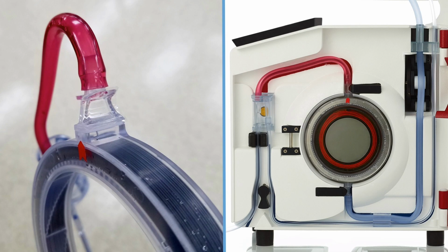The heating fault alarm will most often occur if the disposable set windows or infrared temperature probes are wet, dirty, or blocked. After cleaning and drying surfaces, press retry to continue.